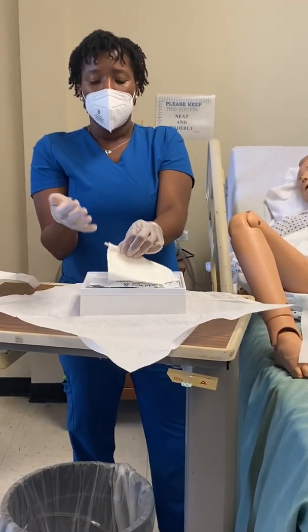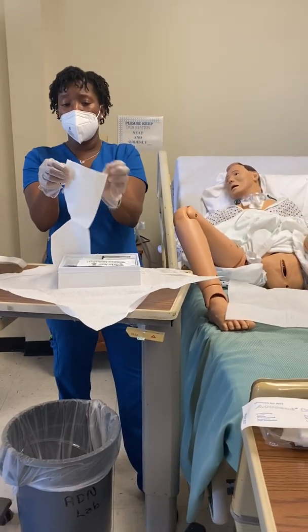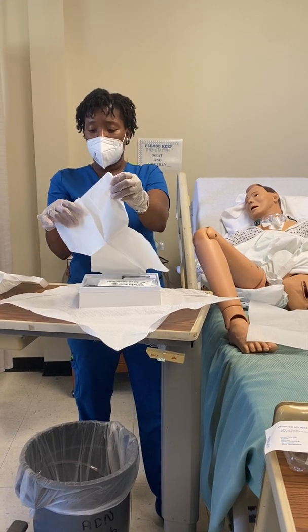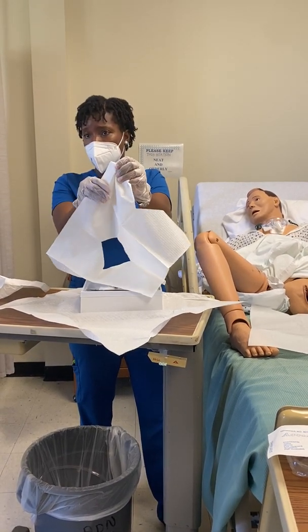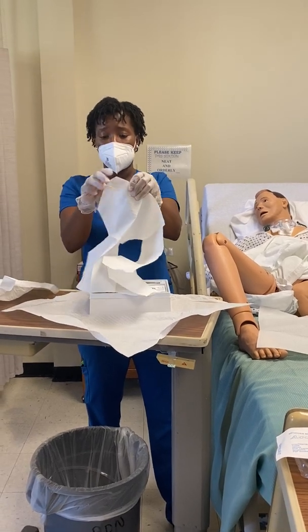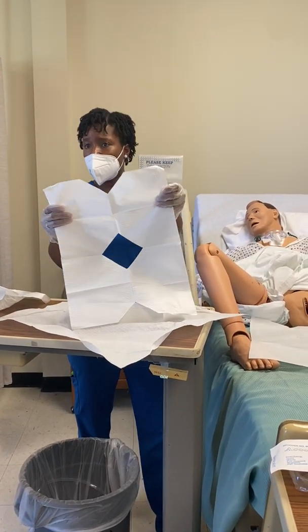Now, some people choose to do these, you guys, before they put their gloves on. Whatever works for you works for me. But I don't want to be fooling with my sterile field when I don't have gloves on. Because that increases my risk of contamination. Now I can touch it anywhere.